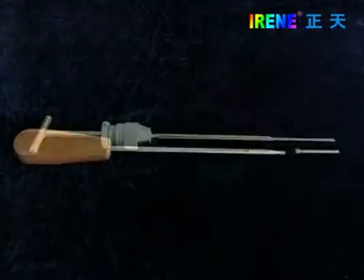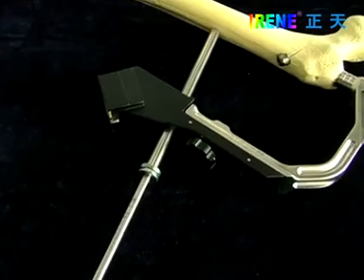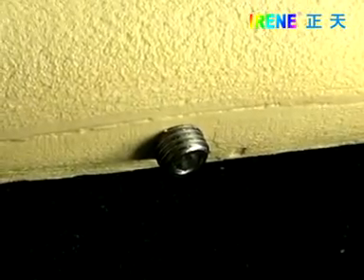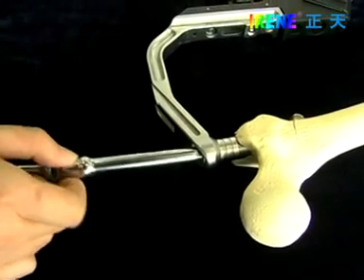After tapping, use the screwdriver to fasten the locking screw. Finally, insert the end cap and disassemble the insertion handle.